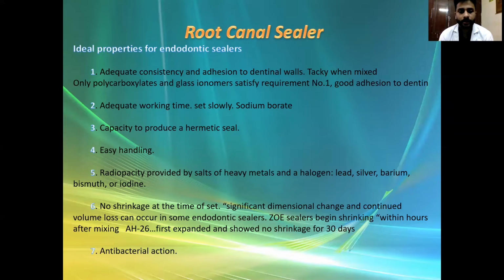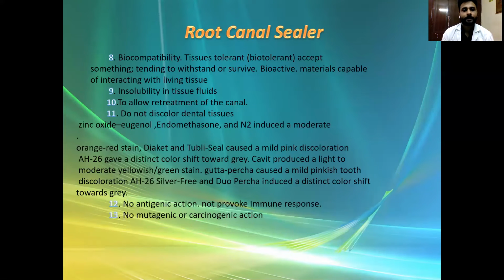Significant dimensional changes and continued volume loss can occur in some endodontic sealers. Zinc oxide eugenol sealers begin shrinking within hours after mixing. AH26 first expanded and showed no shrinkage for 30 days. And finally, they have antimicrobial action.